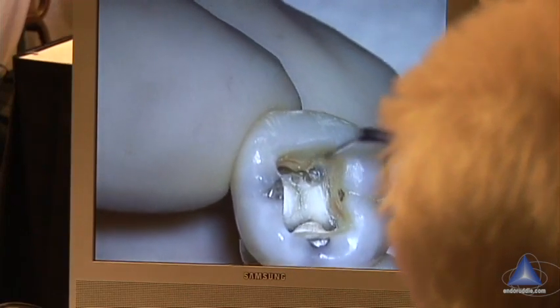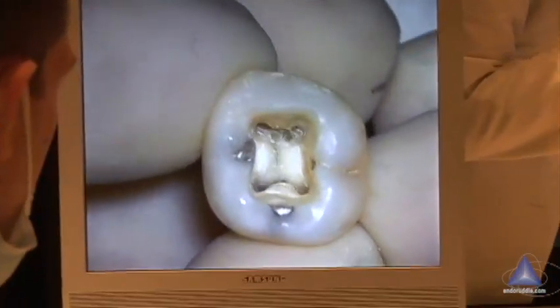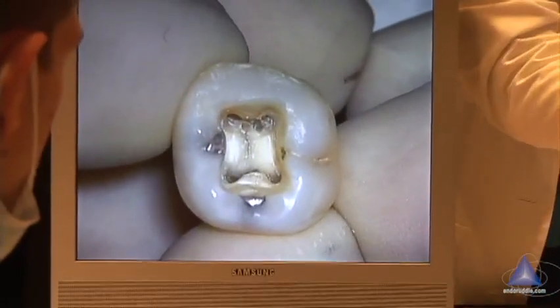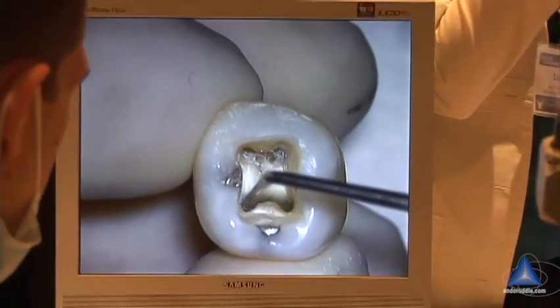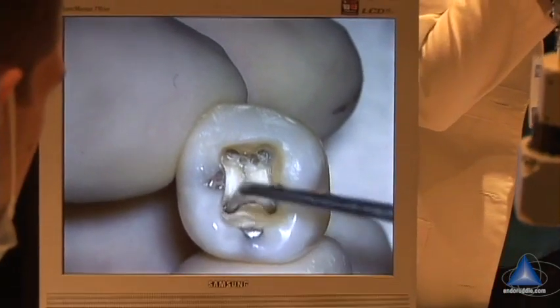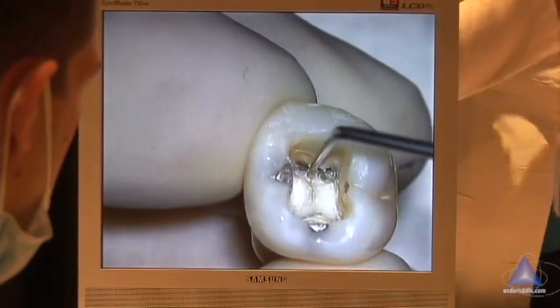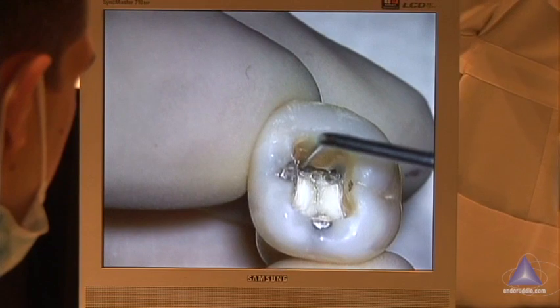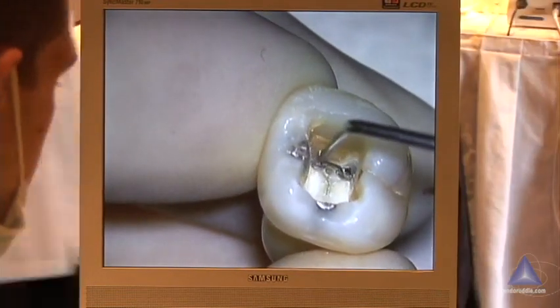Your walls are nice and flat. If I hold this really still, I can't really see everything because there's some stuff going on in here. I could probably do a little bit here and a little bit here. I would like to take this back a little bit — shave that one, and then shave this back there. Not all up here, just this little job.